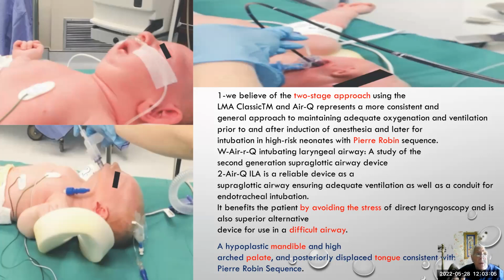Whenever and where we use the conventional supraglottic device, the simple one manufactured by Brain, and after the stabilization of anesthesia, we shift it to one of the supraglottic devices, or what we call an intubating supraglottic device, where we introduce the tube through it. And this figure is illustrating the process.